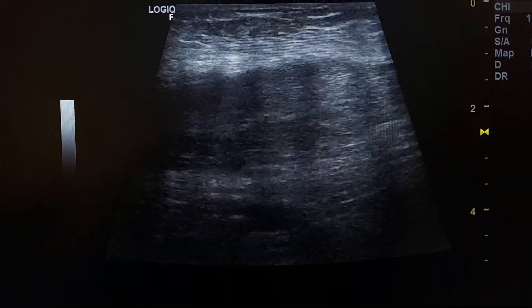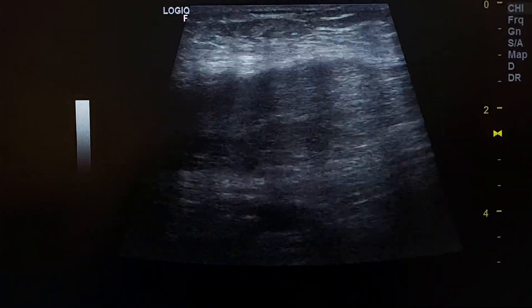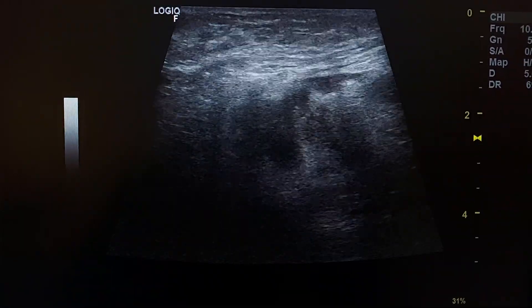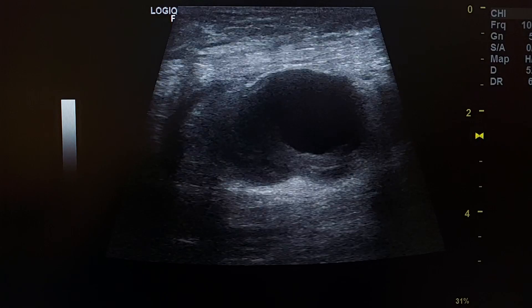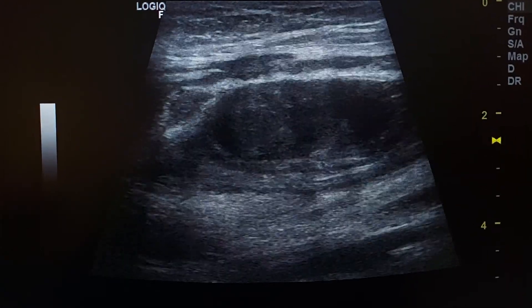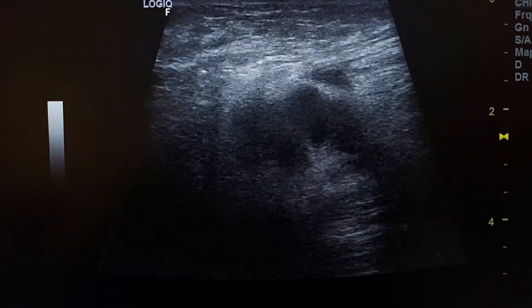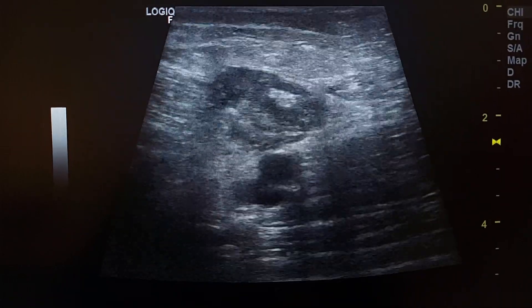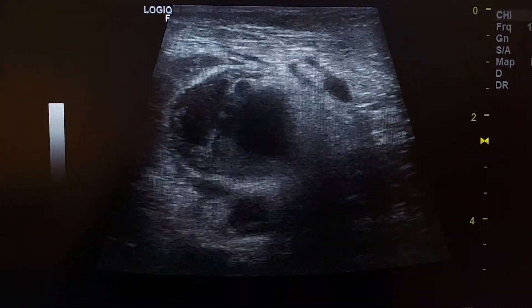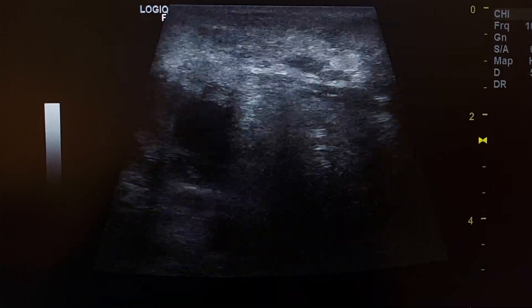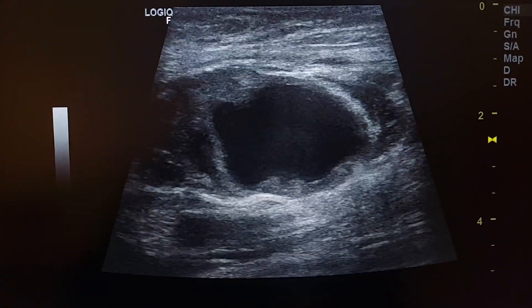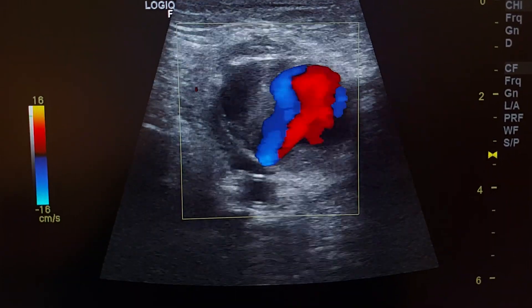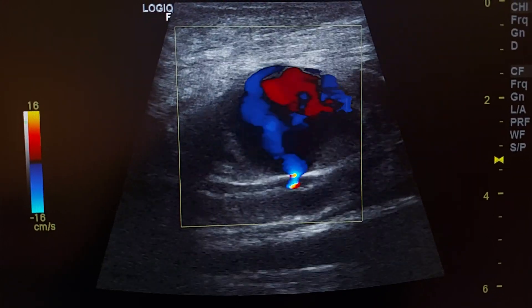This is the superficial femoral artery. Pseudoaneurysm after cardiac catheterization — this is the next section, showing the upper section, followed by transverse and longitudinal sections.